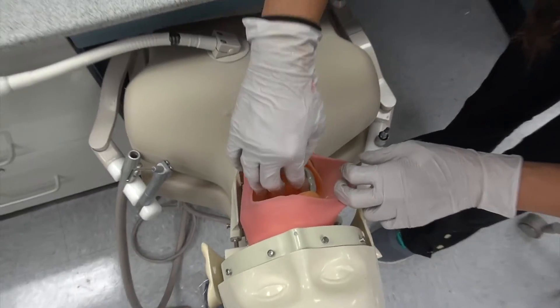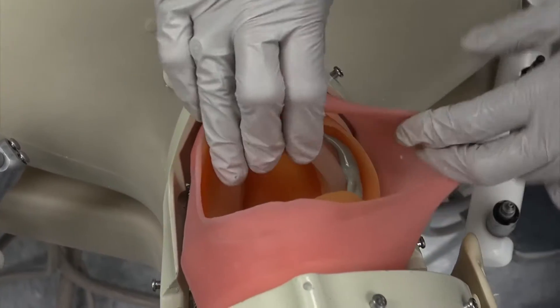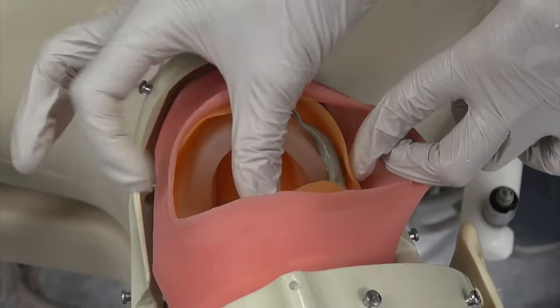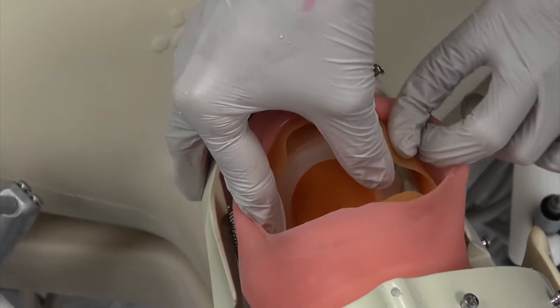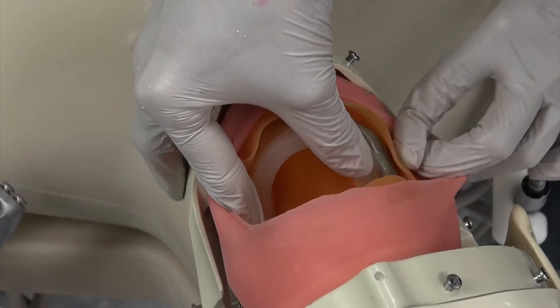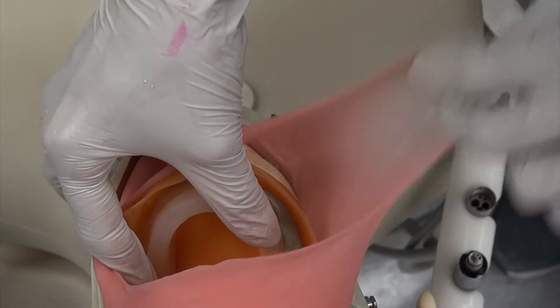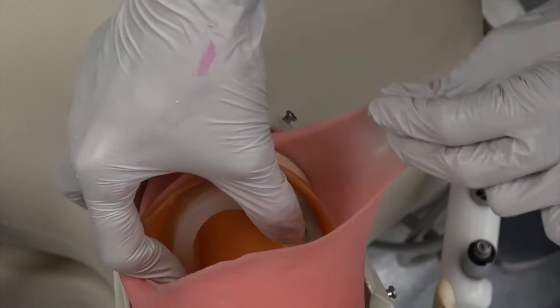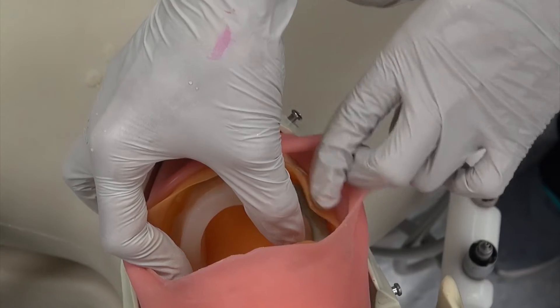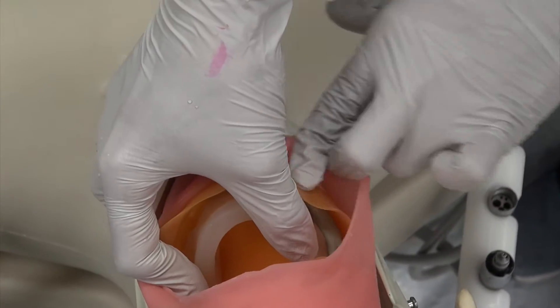Okay, after 30 seconds, you can put it in. And you want to press on the plastic molding. Intra-orally, you would be pulling on the patient's cheek for them, but since this does nothing to it, you want to be pressing on the plastic compounding.